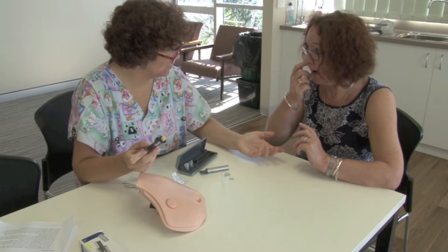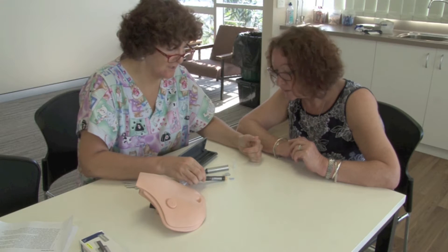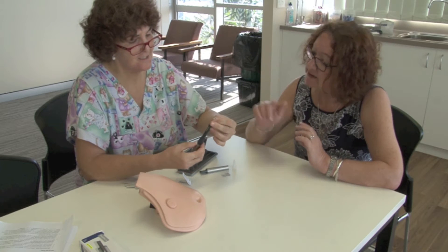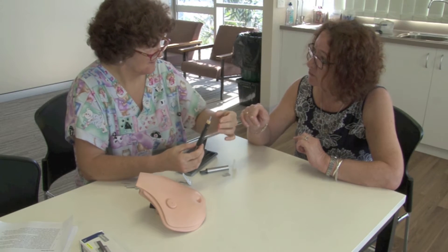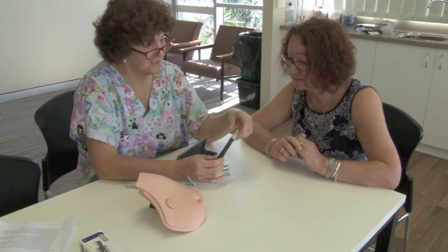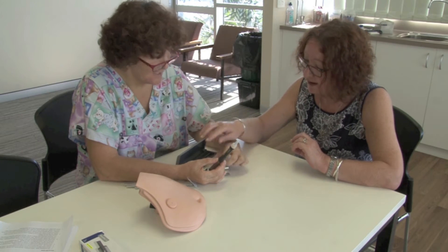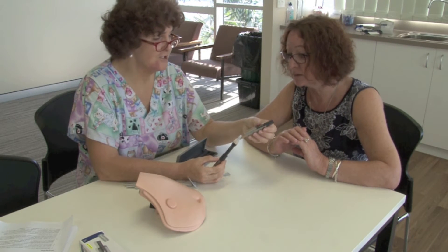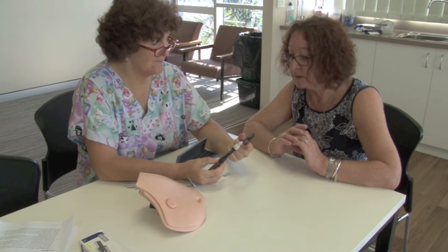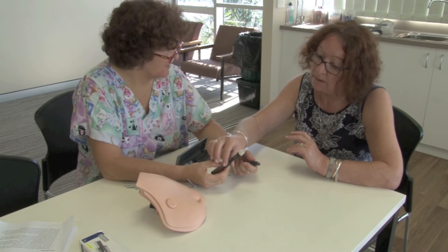And then what we need to do — because you're doing this yourself — I usually just leave it on the table. In the hospital we don't recap, but lots of patients in their home setting do. I think they told me I can use that needle several times? That's absolutely correct. So you might just want to put the cap back on — the safety guard — and then pop it into the fridge.